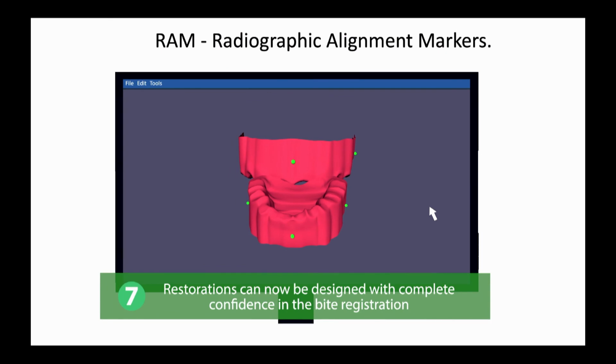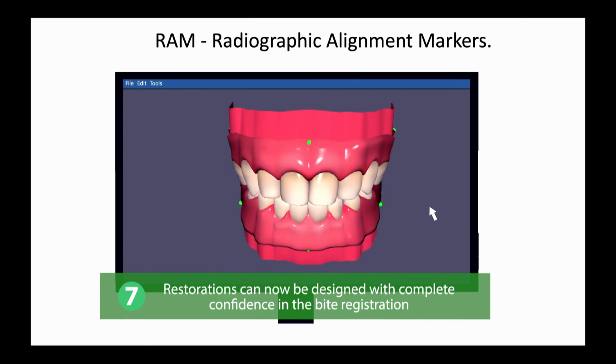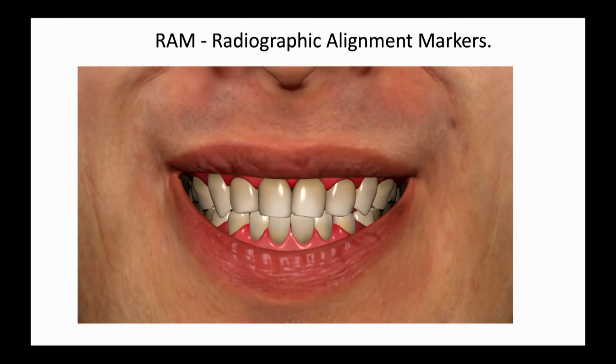And now you have your jaw-to-jaw relationships. And digitally, Patrick then can make the final restorations without ever having the case on an articulator. So again, there's lots of advantages of this. You have the initial teeth that you have scanned in. So when he's designing and machining the final restorations, what you didn't like about the initial teeth, you can take away. And again, it takes a pretty skilled laboratory technician to go through this whole thing digitally, but the software is advanced enough that it can be done.